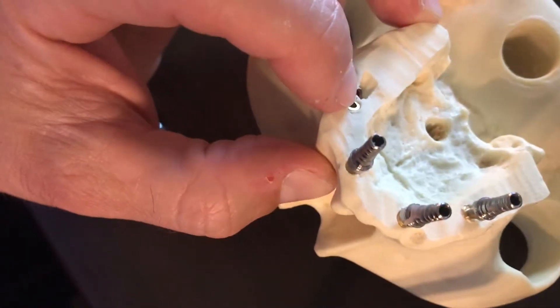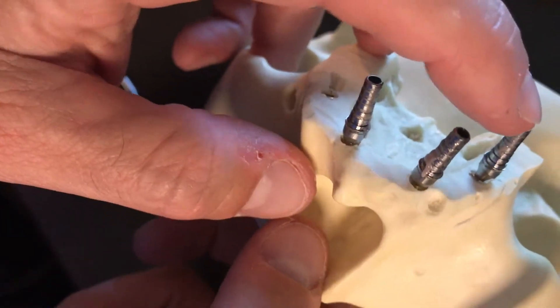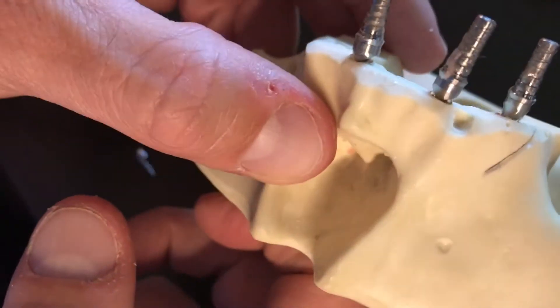Our goal is to make sure we get at least four implants along the arch with primary stability. If we're going to load them that day, we want to try and get these titanium temp cylinders as close to parallel as we can to one another.